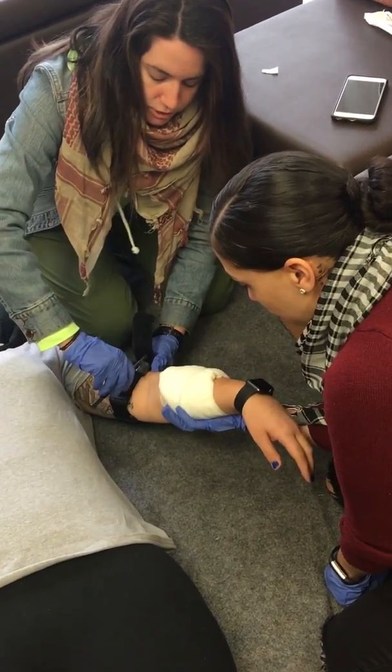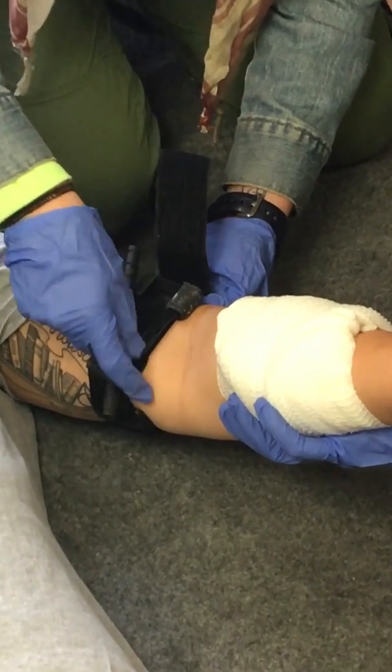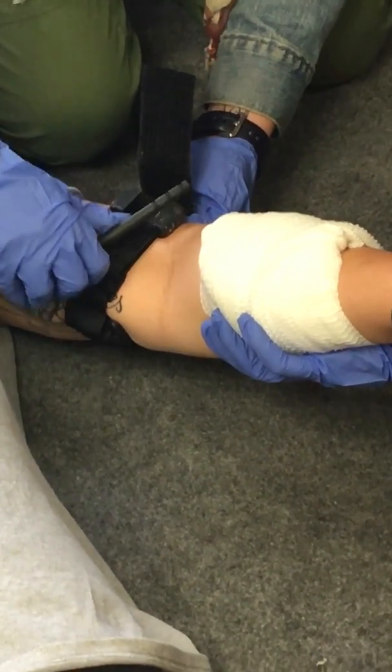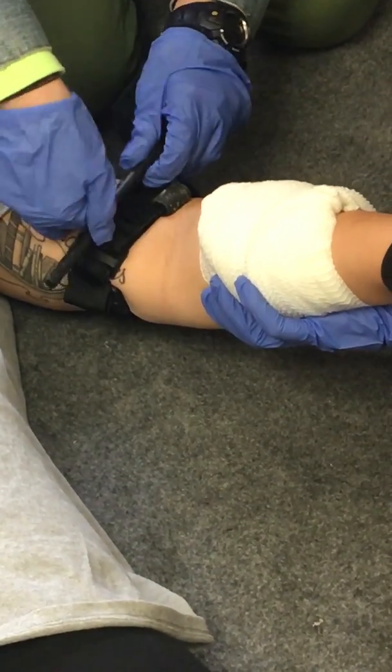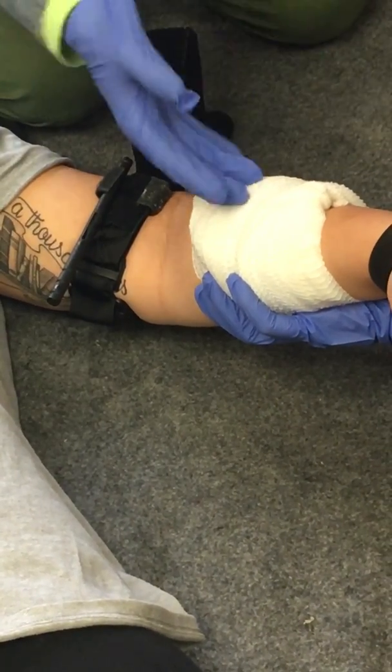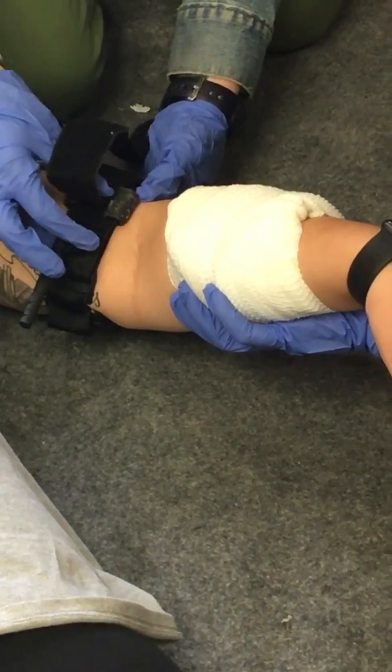Okay, and now we're going to turn. I'm not going to turn too much so I don't cut off your circulation completely here in real life. Okay? You're good. Keep going. Fine. All right, well, you asked for it. Okay. And now we're going to say, is the bleeding controlled? No, bleeding's not controlled.